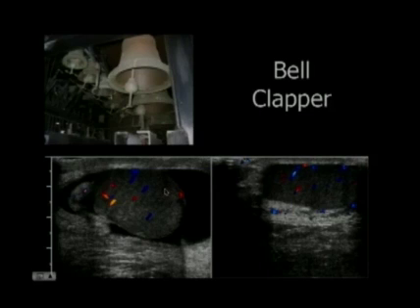Now, this child had acute scrotal pain. He's got an enlarged testis compared to the other side, but right now he doesn't hurt, and that's a key thing that we'll get into. His pain is better. He does have flow. He doesn't have a problem right now, but this is abnormal.